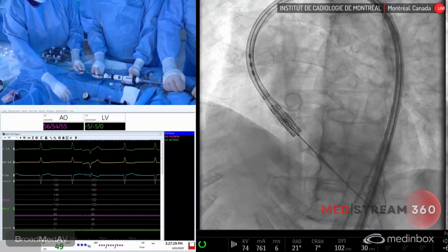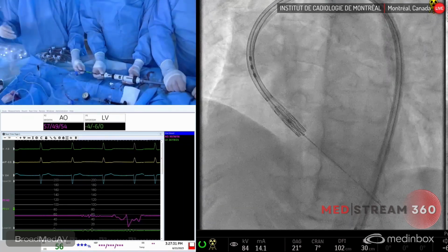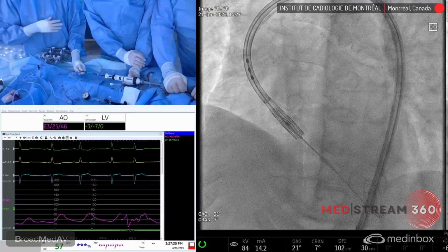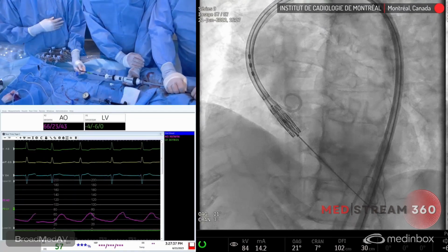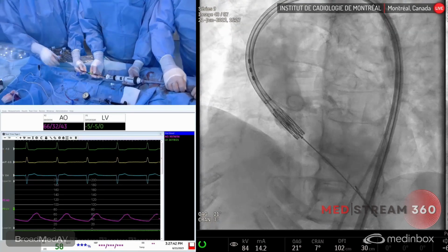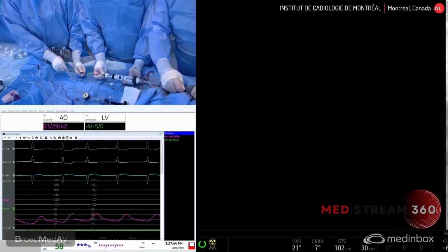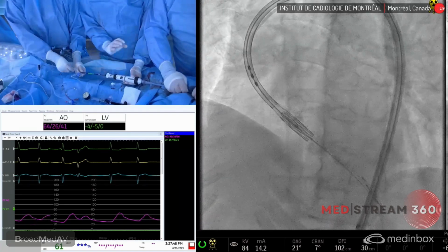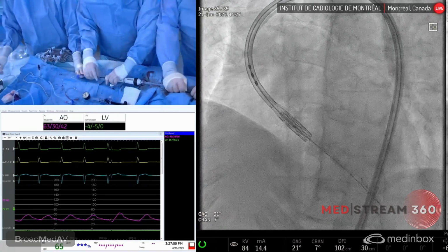Move forward a little. So I might advance it a little more. I find it a little bit high. Can we just let the ortho play, please? Yeah, because we see the left main, so I think we need to advance it just a little bit more, which you probably already did, Fluoro. Just a little bit more. Perfect. Okay, so we're going to bring the pusher back.